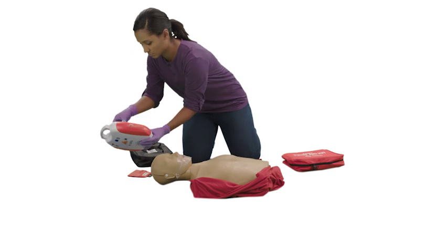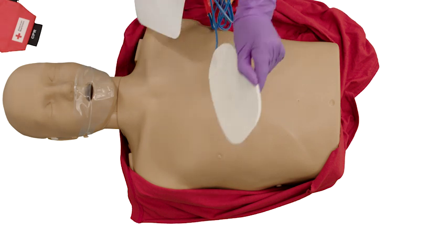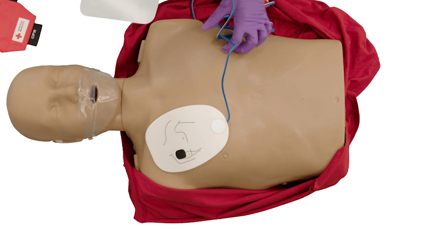Attach pads firmly to the person's chest as shown. Using the appropriate sized pads, place one pad on the upper right side of the chest and the other on the lower left side of the chest below the armpit.